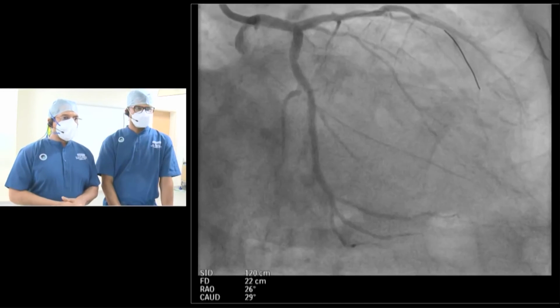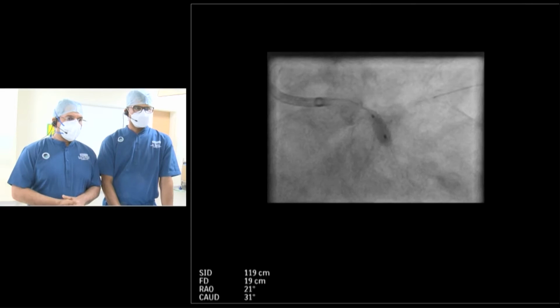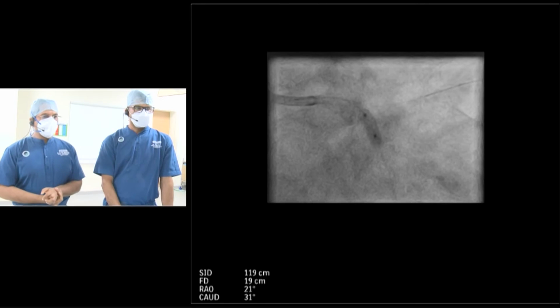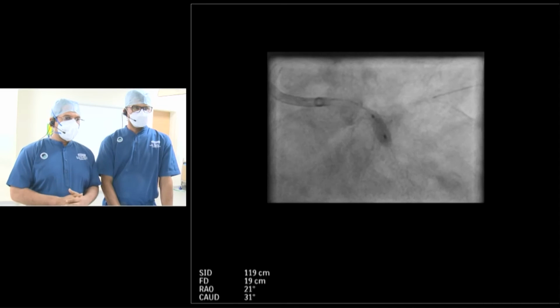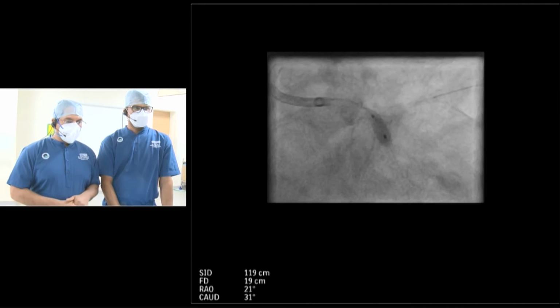After that we rewired the circumflex. We made sure that the wire passed through the proximal strut. We didn't do an OCT here; we went by StentBoost. The circumflex stent was dilated serially, initially with a smaller diameter balloon, and then with a 3.5 into 8 millimeter NC balloon. We went up to 18 atmosphere.